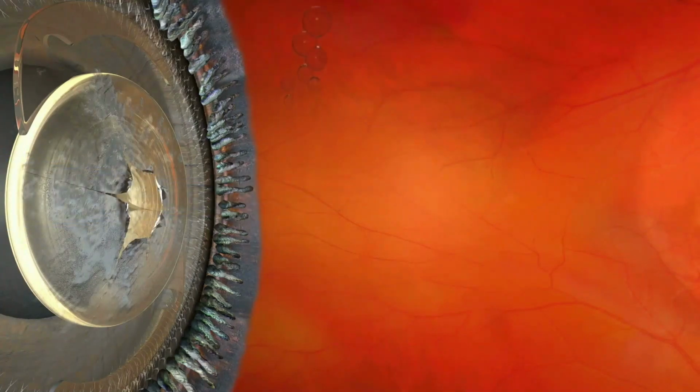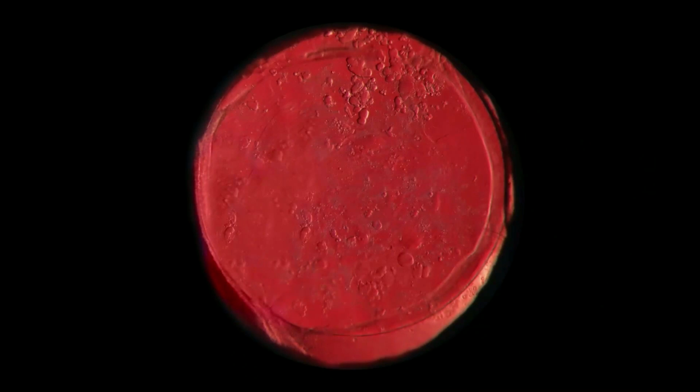And we can observe this phenomenon in another 3D animation. A capsule opening centered on the optical axis is achieved. Ideally, it already has the shape of a pentagon or hexagon. Now I will show you the effect from the surgeon's point of view.